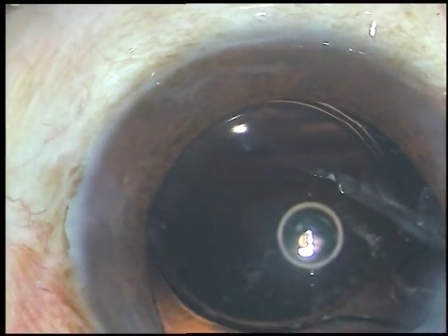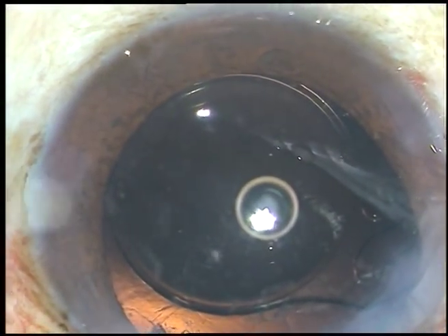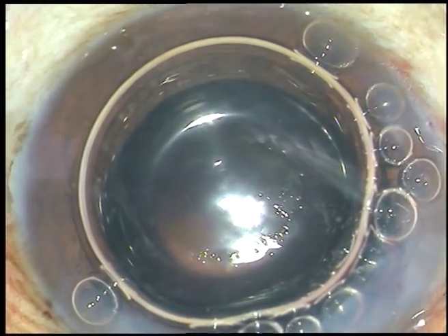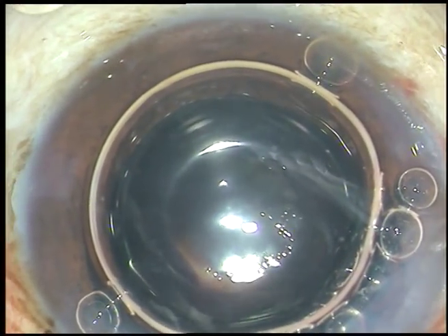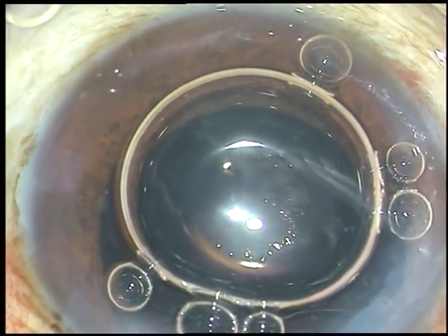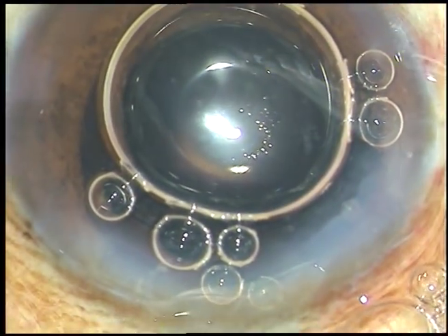We can see there is a lot of vitreous, so we have to trim these vitreous strands. My plan is to inject an air bubble and then pilocarpine to constrict the pupil as much as possible. This is pilocarpine 1% intracameral preparation, available in the market and usable intracamerally. We can see the pupil has started constricting from the inferior aspect, but the superior aspect is not constricting, indicating that the pupillary margin has been hooked by the vitreous strands.